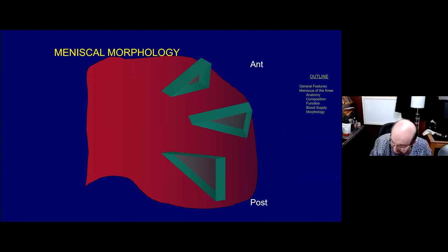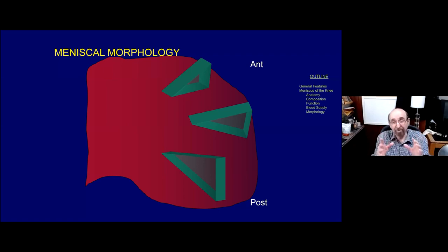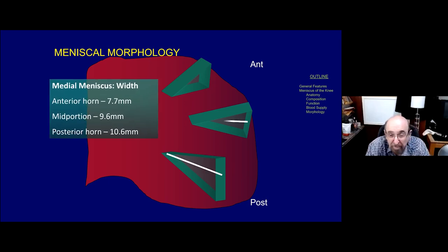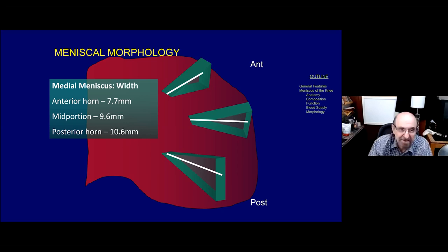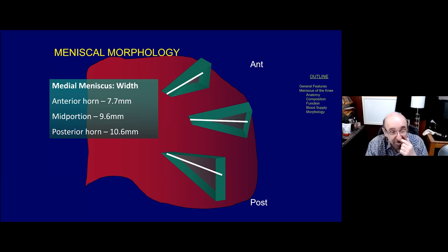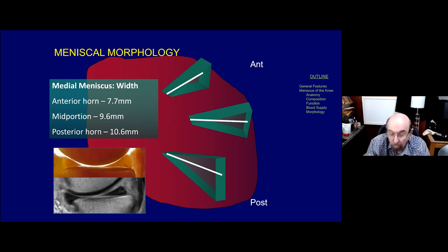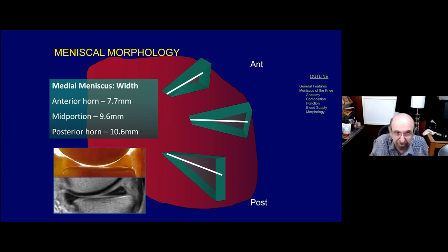To understand tears, you have to understand normal meniscal morphology. Looking at three parts of the medial meniscus - posterior horn, body, and anterior horn - what you need to know is its width. The widest part of the medial meniscus is the posterior horn; the mid-portion can be very narrow. A quick way to survey the integrity of the medial meniscus on sagittal images is to compare the width of the posterior horn to the anterior horn - the posterior horn should be wider. If it is not, there's a problem.